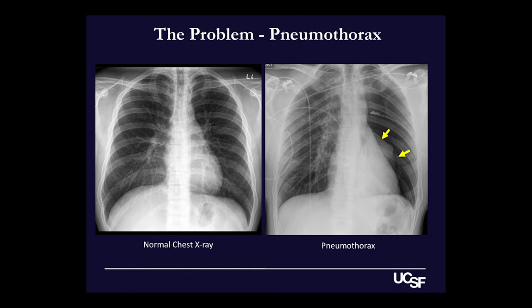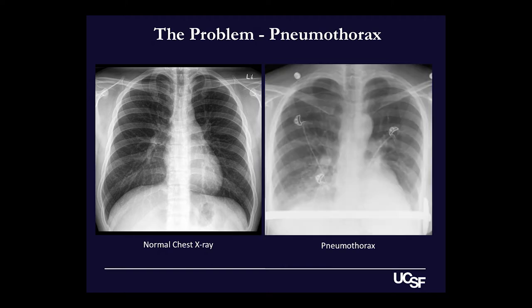Pneumothorax isn't always as obvious as this particular example. Here's another one where you can see that the lung markings don't make it all the way up into the upper right chest. They end at this curved line here, which turns out to be the edge of the lung. In fact, if you look even more carefully, there's another one on the other side that looks pretty similar, but it's a little harder to see.